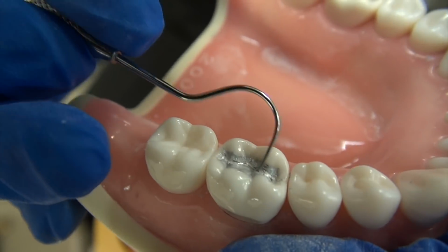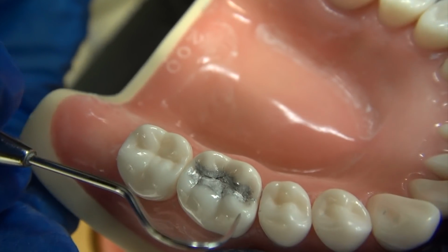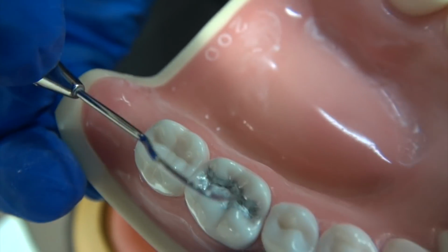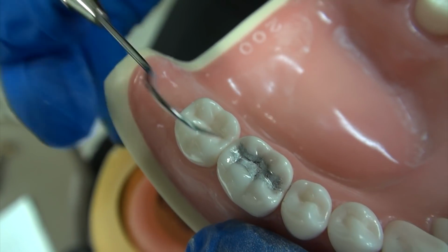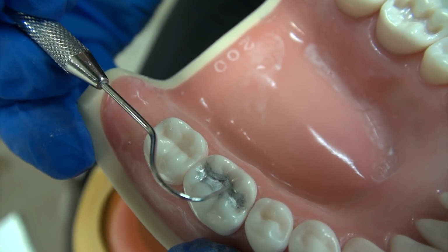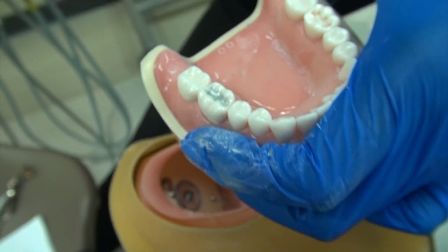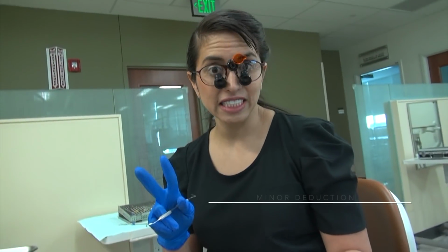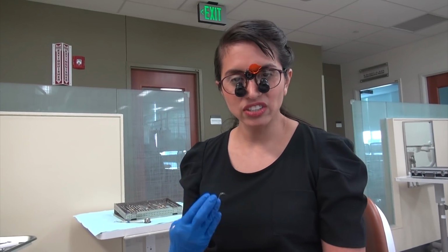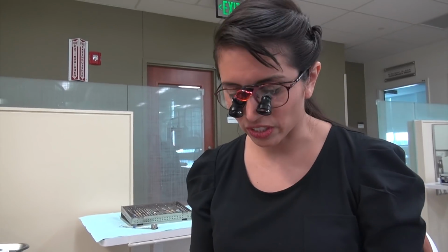Now, see how I really have that nice ridge here? If you blow that out, well, that's an easy way to get a deduction. The most common submargination, and it almost counts as two categories, because if you end up submarginating on the mesial ridge, triangular ridge, then you're also going to lose that anatomical form. So you have to be careful, because in some areas you can easily get two areas of deduction. Okay, so just making sure that you practice that mesial ridge and make sure that you are paying extra attention to that area, because that's one of the more common areas of submargination.